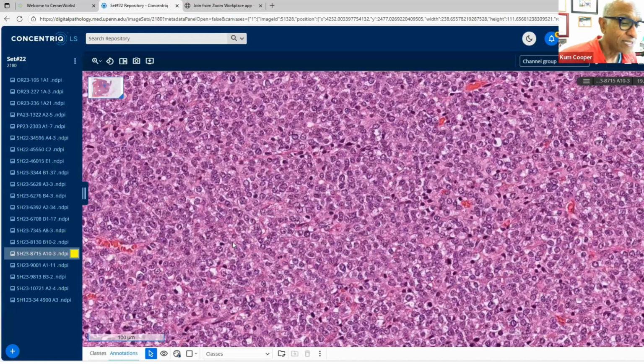I like epithelioid sarcoma. You have to address that as well. And you all know that those are keratin and EMA positive, and I've already given that out, that, excuse me, that keratins are negative, EMA is negative, and CD34 is also negative. So we'll get that triad of markers for epithelioid sarcoma. That's what I like to do.